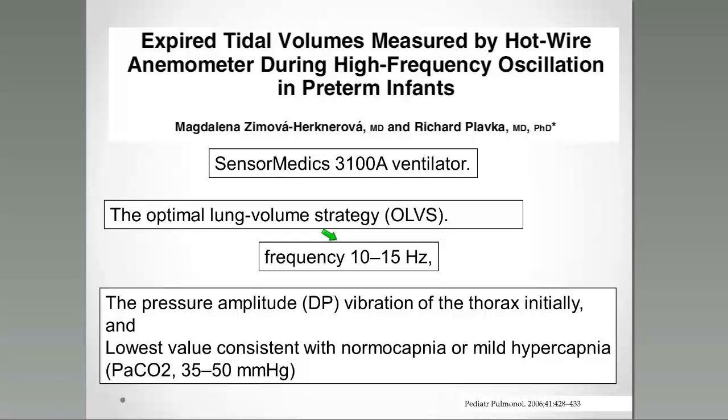How important is it really to know the tidal volume during high frequency ventilation? Well, I think yes. It's so important that if you have the measurement of the tidal volume, you can see if the baby is going to be hyperventilated, hypoventilated, or normally ventilated. Let me show you. This is a very nice study from Magdalena Simova in 2006, where she connected, during high frequency ventilation using a SensorMedics standard oscillator, very premature babies, very small babies, lower than 1500 grams, to a flow sensor.